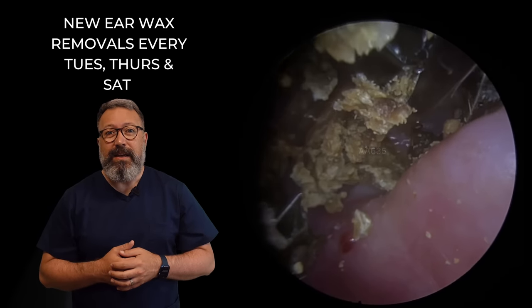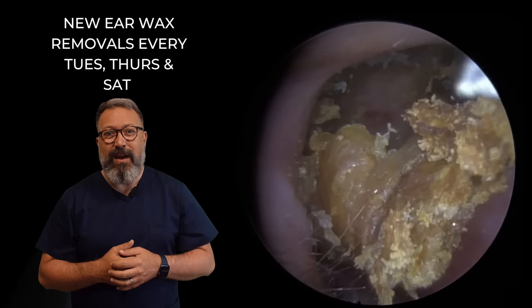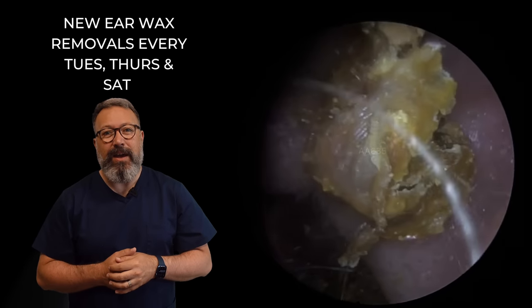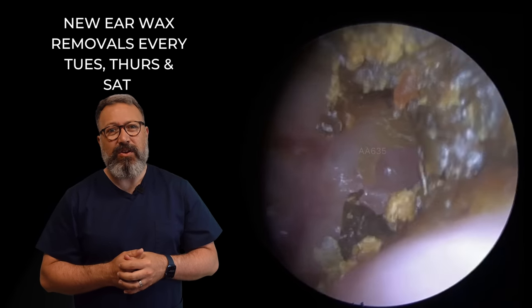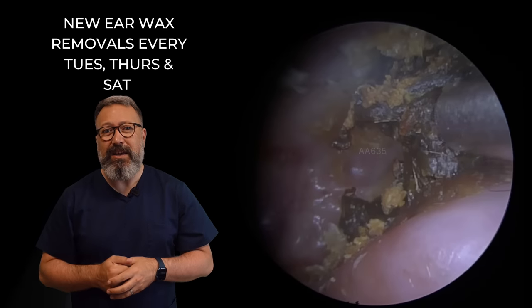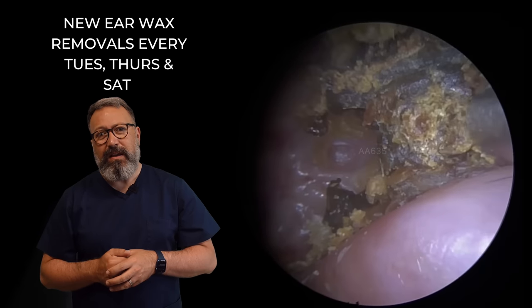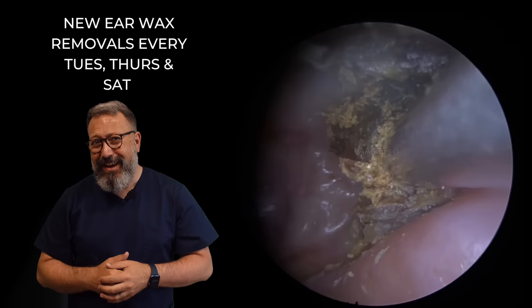We're just going to be able to get a grip on this. Look at that whole section come away there — some big, big pieces. You can see that bit that actually broke off in the end of the forceps there. We can see that coming away — that really, really tough layer there. So how are we looking now? We've got a little bit of debris up here just to the top right, and there's that ledge going all the way around. A little bit of debris to the left-hand side as well. Don't forget, this is all above the eardrum — what you're seeing here is the actual cavity itself. Look at the pressure I'm having to put on that wax with the suction tube just to get this moving.